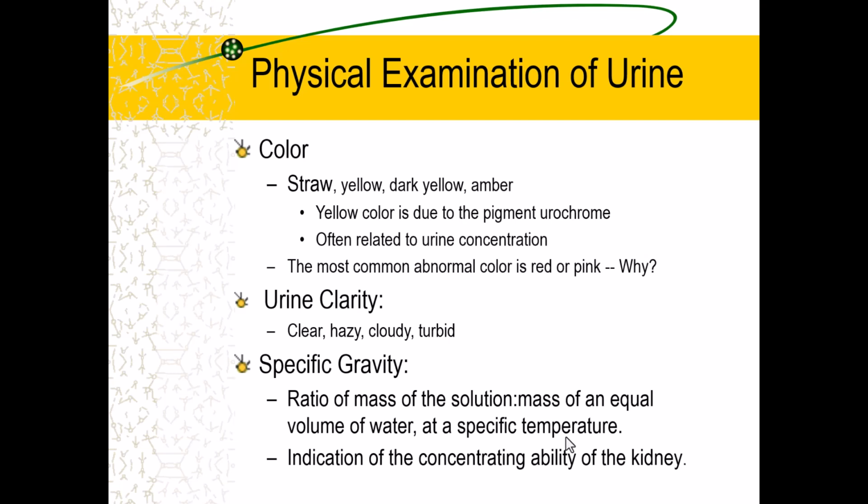One thing we always have to remember is when we're dealing with a urine cup, sometimes the urine cups have a bit of turbidity to them. So you have to, in your brain, tare, T-A-R-E. Remember when we did the scale, so you talk about taring the scale? You have to tare that away. So is it clear other than the color of the container? You have to mentally take away the color of the container to see how clear we're looking.